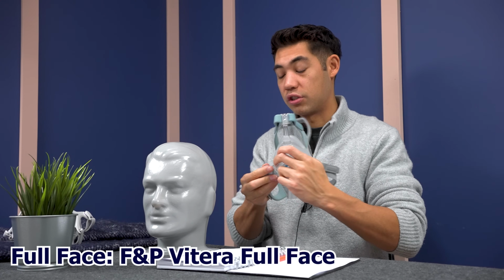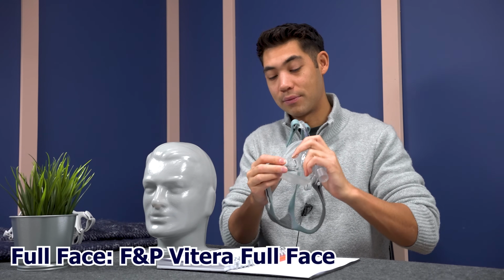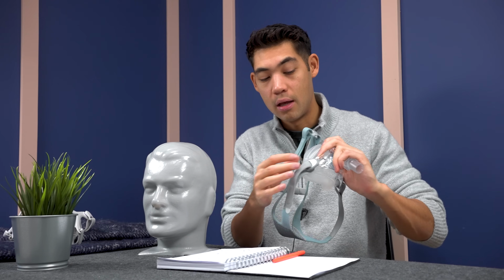I'm going to go over that now. So putting it on, we have clips here. With side sleepers, you move a lot. The clips might hold a little bit better than magnets that you see on the ResMed.